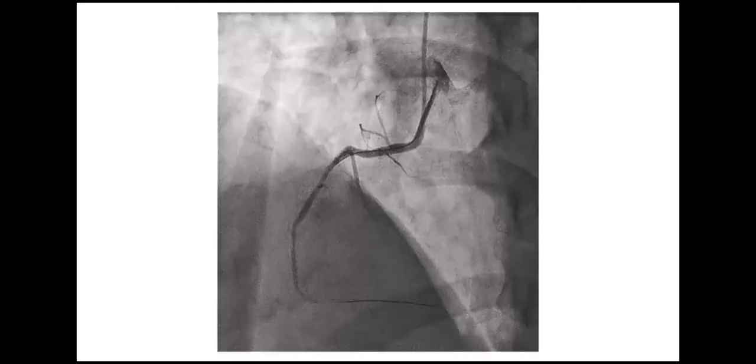For the interventionalists who are doing the STEMI, my advice is don't be too brave. At least put a venous line, ready to put a temporary wire. You don't need to be too brave. But I did it reckless anyway. And I gave dopamine after this. After the dopamine, I said if that increases the heart rate, then I'm not going to put a temporary wire. So I used dopamine and then I put the wire and no further bradycardia.